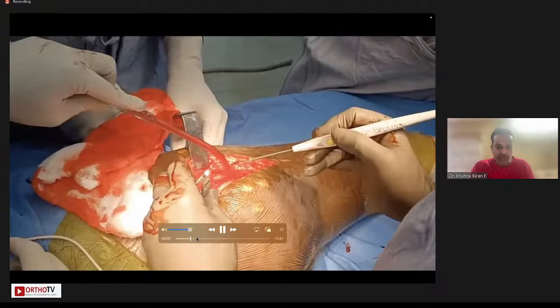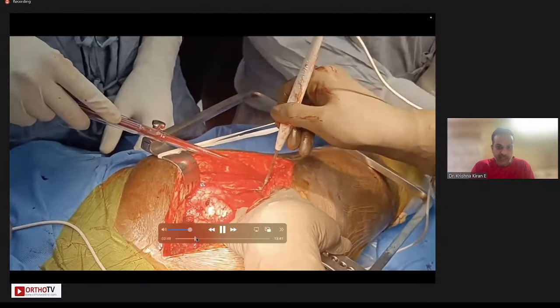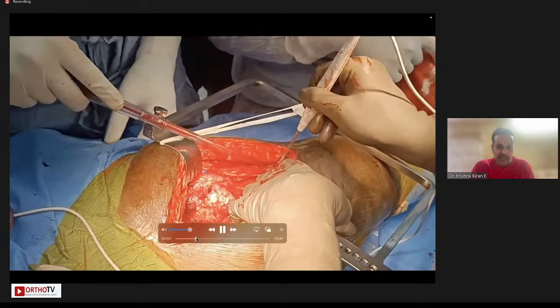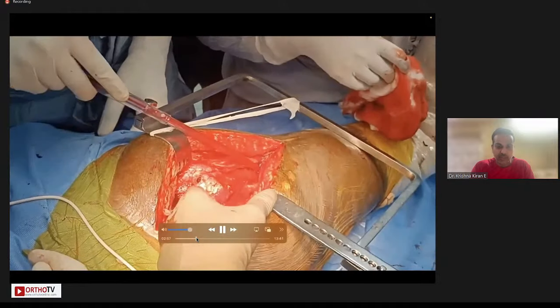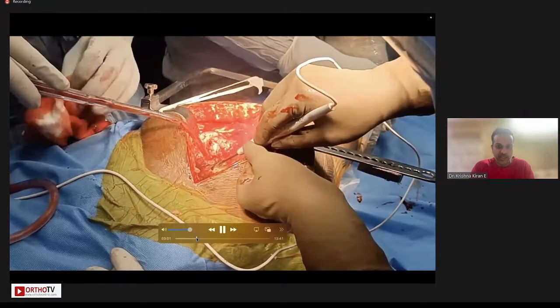And again, the femur, we are mobilizing, releasing the gluteus maximus completely, releasing the anterior capsule, releasing the adductor magnus, releasing the rectus femoris, and finally the psoas is also released in cases where we are not able to internally rotate. So this is the anterior capsule release. You can see from the femoral insertion there, I'm releasing the anterior capsule.